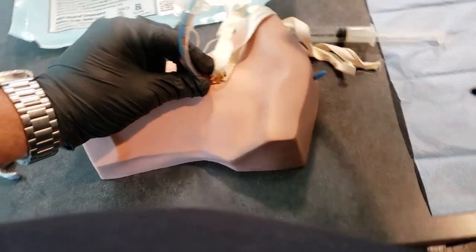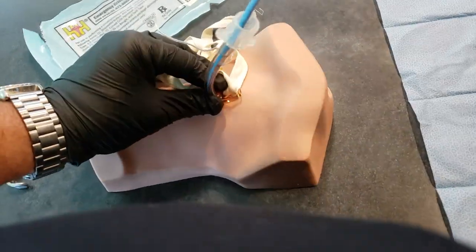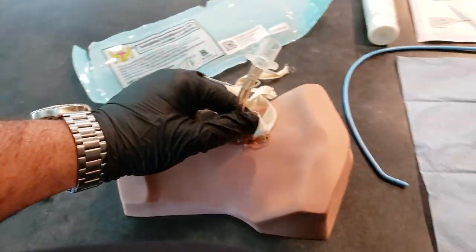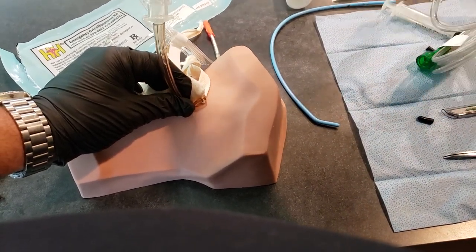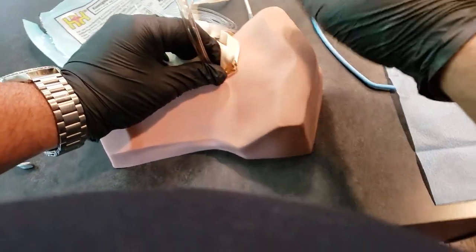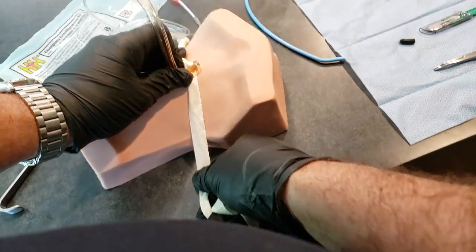You can then remove the bougie and add air to the cuff. You'll use your bag valve mask with end-tidal CO2 on it. Ventilate, listen to lung sounds, and check your end-tidal CO2. Pass off your BVM to a partner and secure the device around the person's neck using the strap.